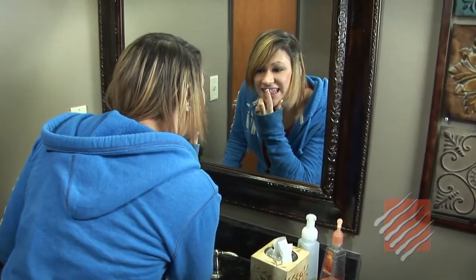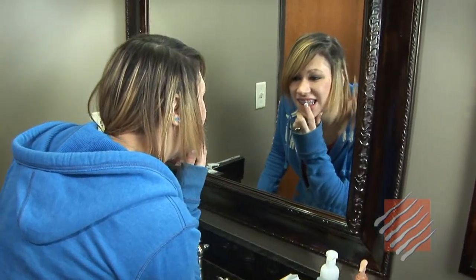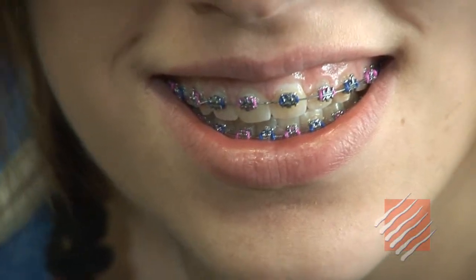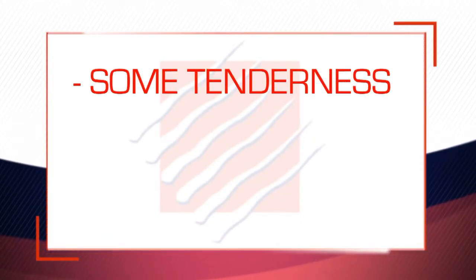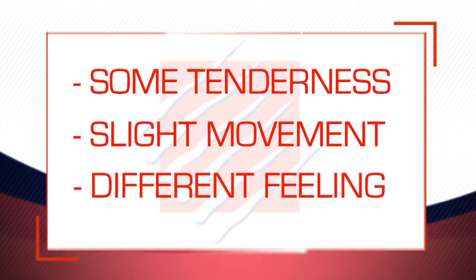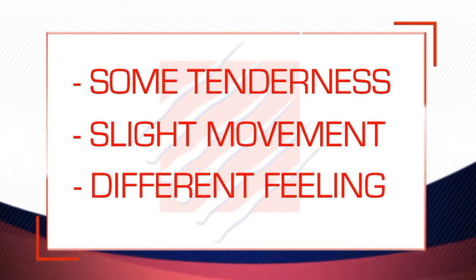Thanks, Dr. D. Orthodontics is a team effort, and to get that beautiful smile at the end of treatment, you have to take good care of your braces and yourself when you're away from our office. The first thing to keep in mind is you may feel some irritation in your cheeks when you get your new braces, and that's normal, and it'll go away as you get used to wearing them. You might also feel some tenderness in your teeth, some slight movement in your teeth, and a difference in the way your bite feels, which again are all very normal.